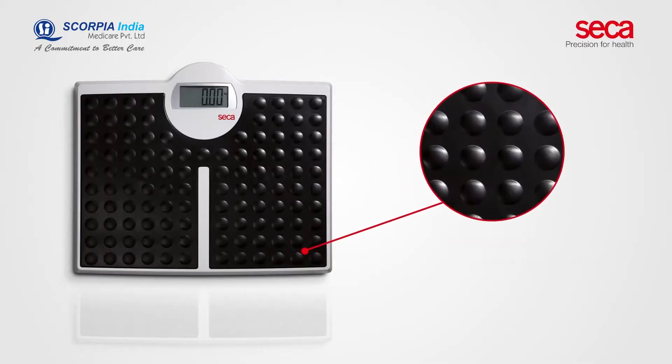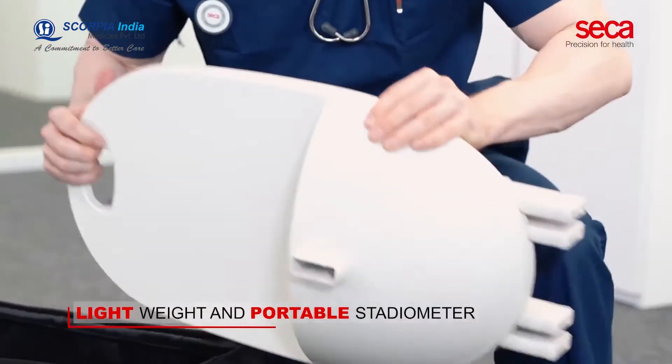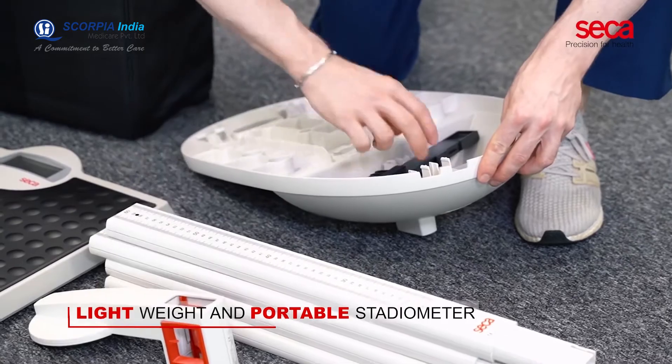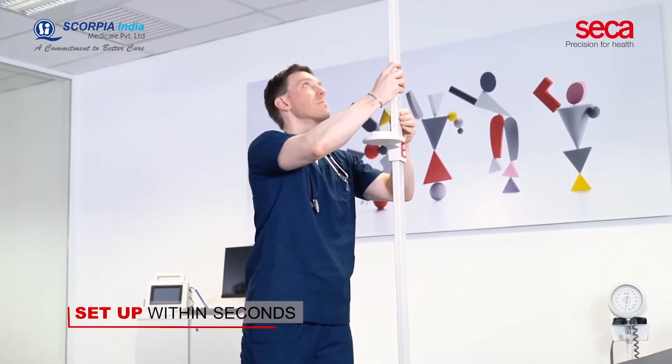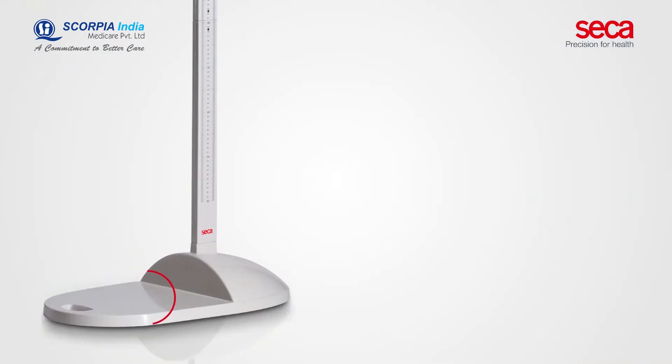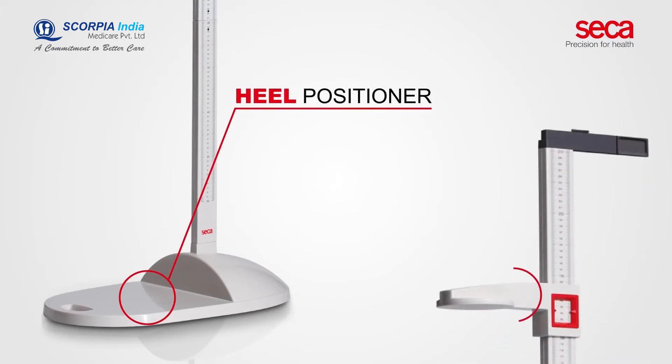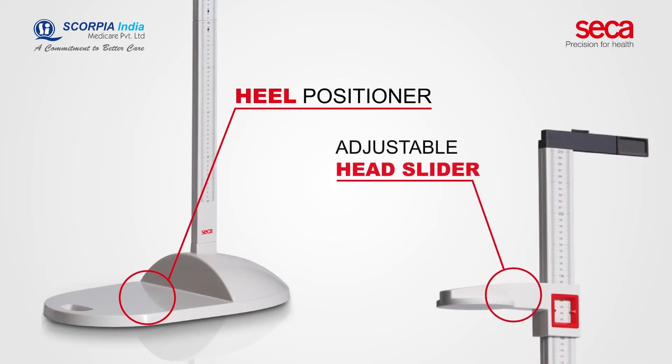The non-slip rubber surface can be easily cleaned. The CECA 213 Stadiometer ensures easy and precise height measurements of children and adults. Its lightweight design allows you to set up within seconds. The heel positioner ensures an ideal measuring position, and the adjustable head slider makes it easy to read the measurements.